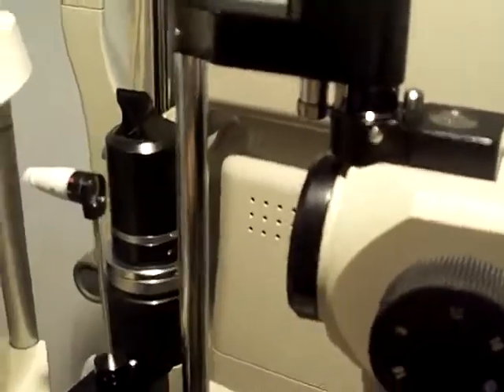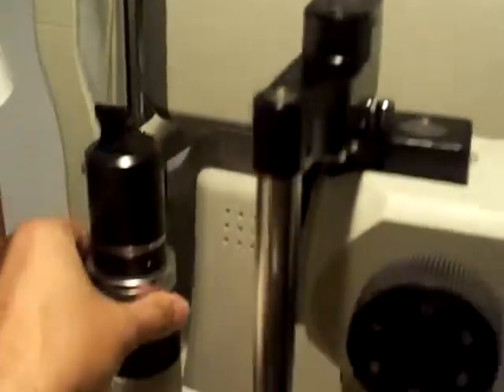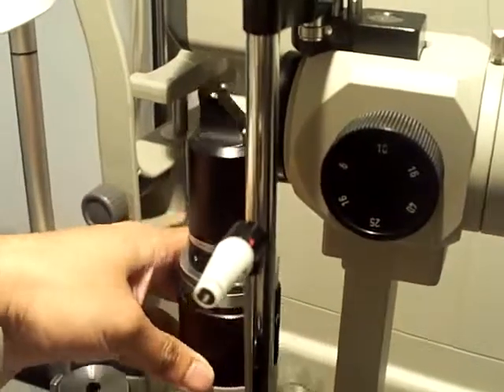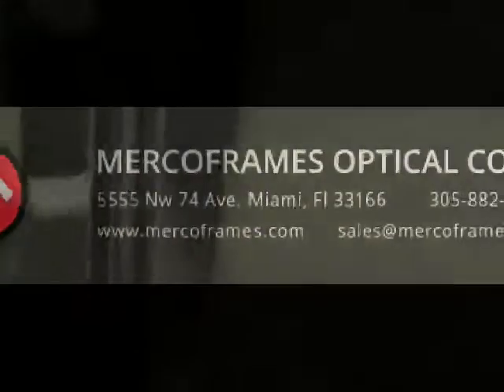If you need to move the illumination arm to the other side, simply unclick it like so, move the illumination arm to the other side, and then move the Goldman Tonometer back.